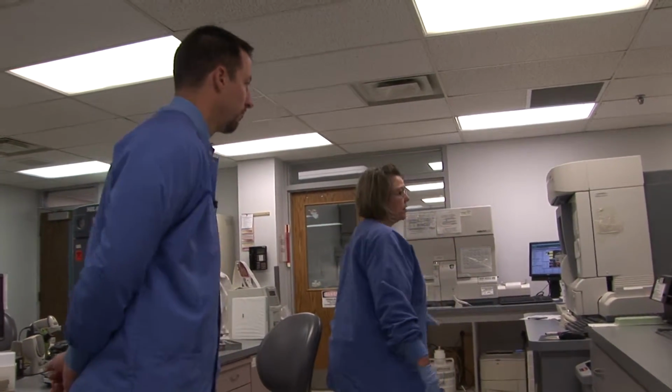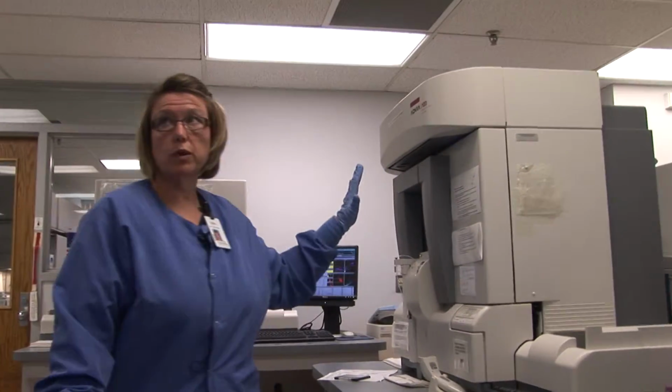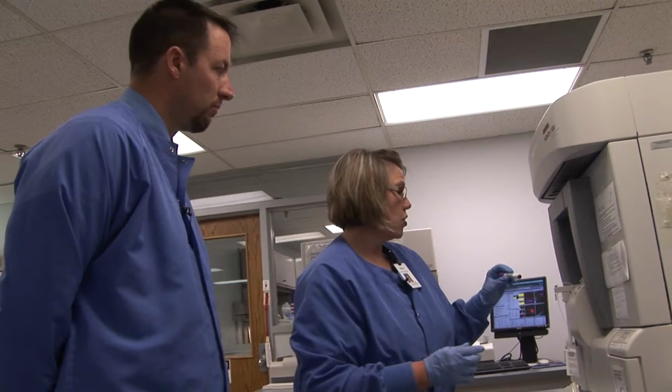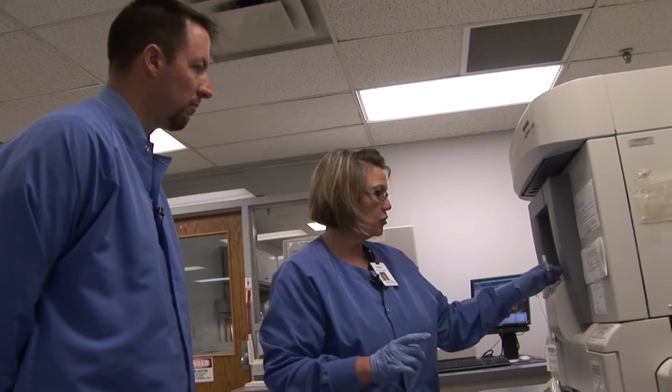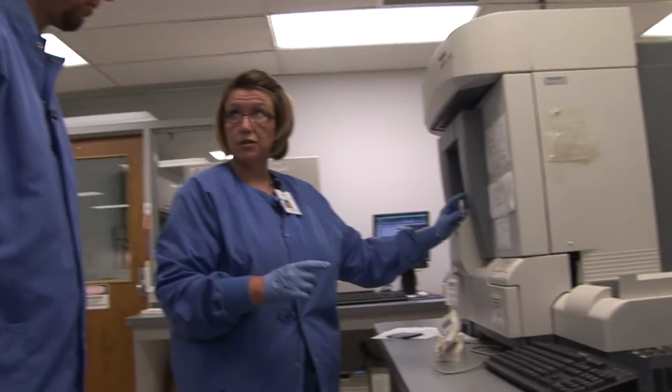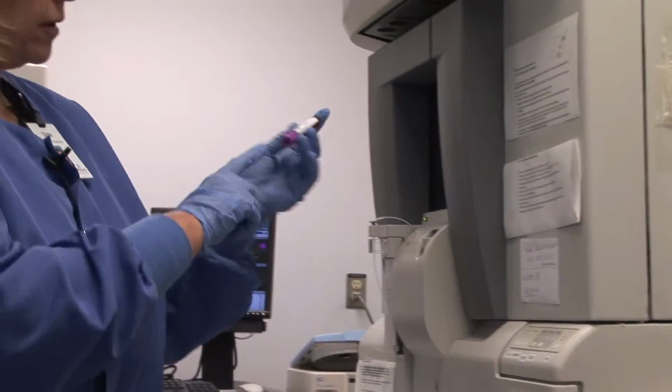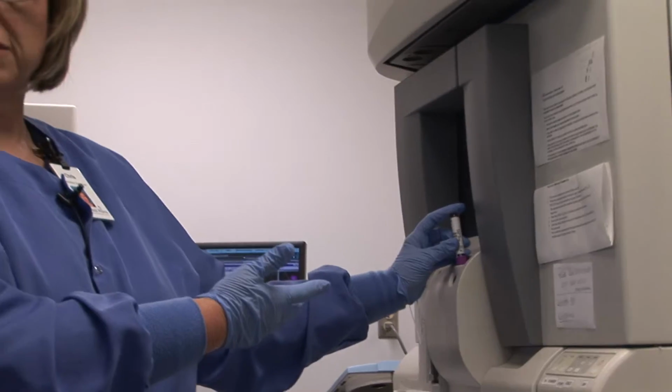to the emergency department. Okay, this is the hematology department, and this is where we look at blood cells and do blood counts. One of the most popular lab tests that we do is a CBC, which is a complete blood count. This is the instrument that we do that on. This is called the Advia 2120. It's one of our more sophisticated instruments that we use. So you're going to barcode this, then you'll turn it upside down, push it down into this hole. A needle will come up through the bottom, through the cap, and aspirate part of the specimen.